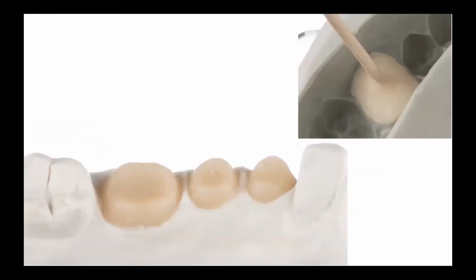And I can use toothpicks, the wooden handle, or I can make this wax die to the impression. There are two ways, by the way, of this technology. The first way is to put the melted wax directly to the impression and form the die this way. The other way is to put the melted wax directly to the crown, after that to remove it from the crown and fix it in the impression, and after that to make the model of this kind.